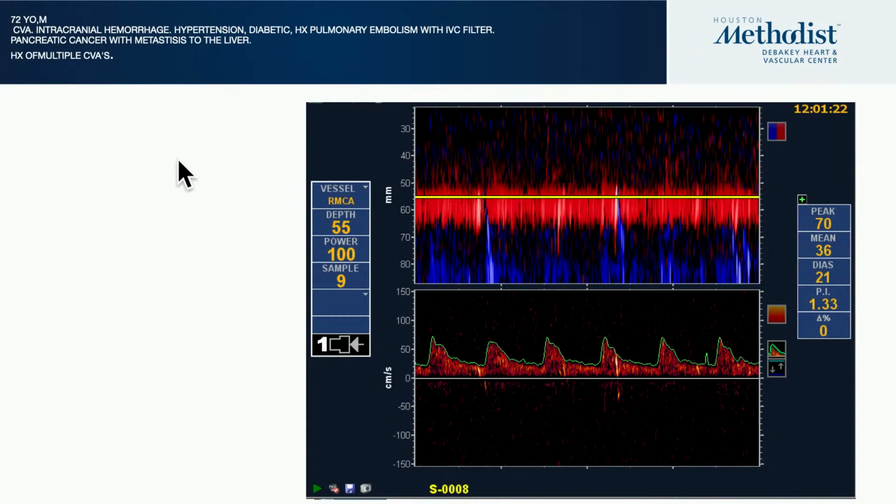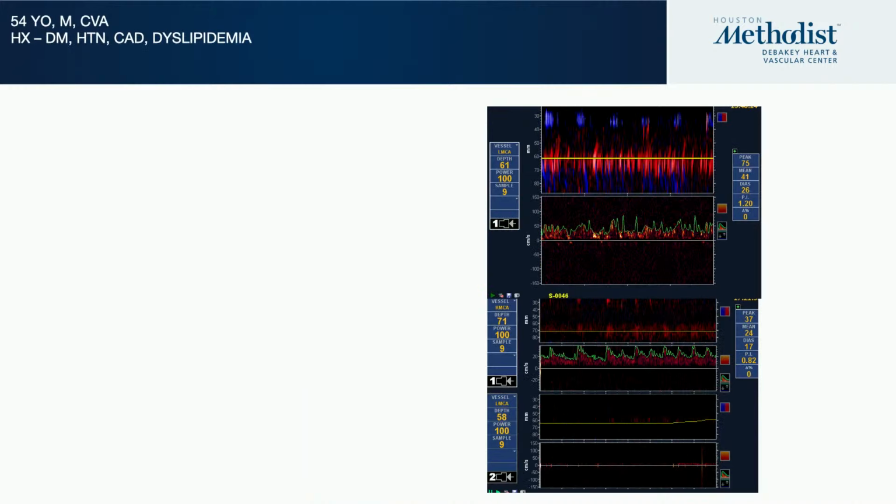I cannot read this one. This is also a stroke with a hemorrhage, but also there was a PE with a filter. And again, I think the last line shows you the issue. So when we have cancer, we do have a hypercoagulable state, and with that hypercoagulable state, you will see much more embolization in the brain as well. And this is another example of how the microembolus signal from one day to another just disappears. So this is a shower of emboli, and next day you have nothing.